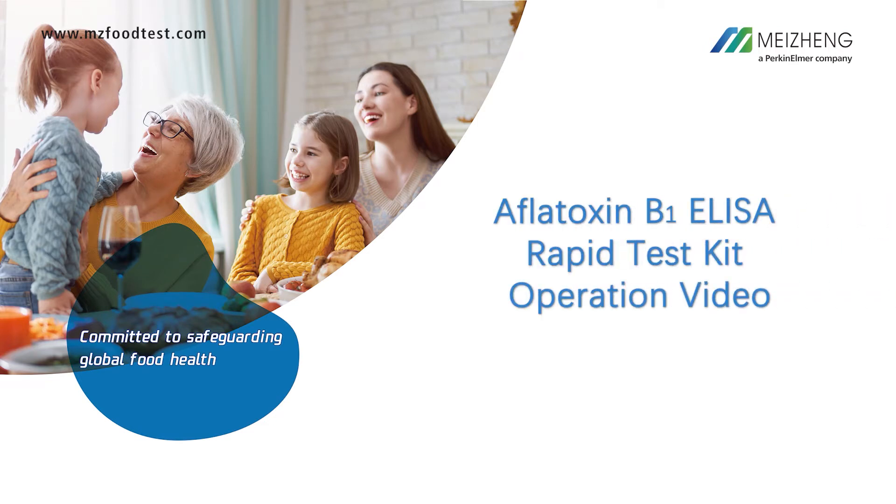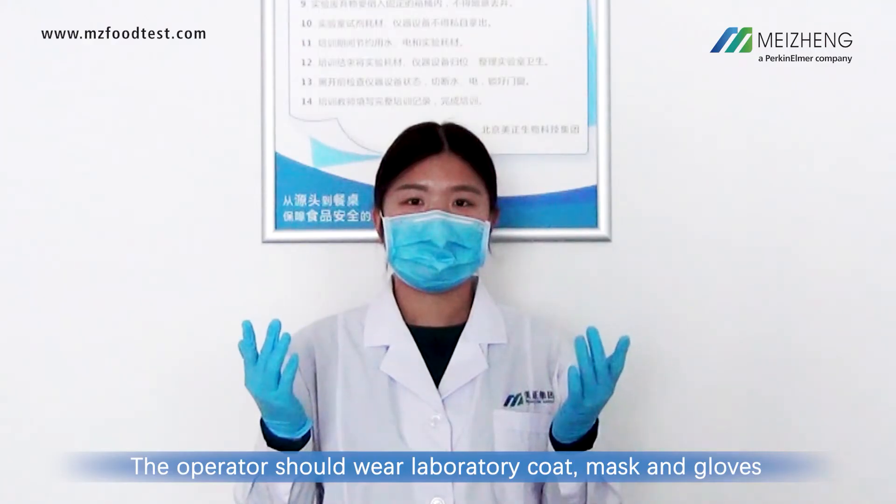Aflatoxin B1 ELISA rapid test kit operation video. The operator should wear laboratory coat, mask, and gloves.